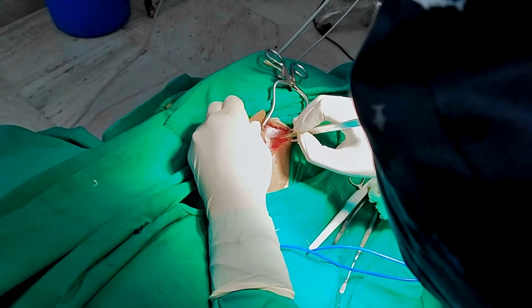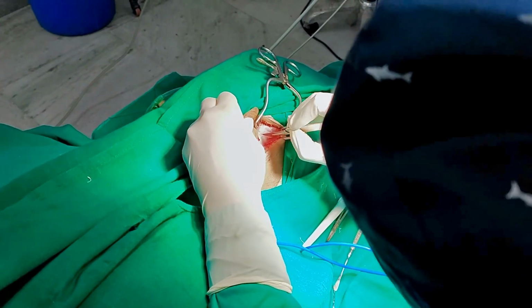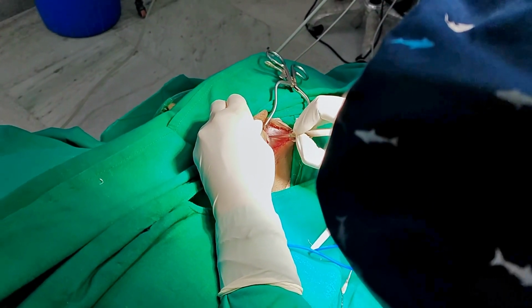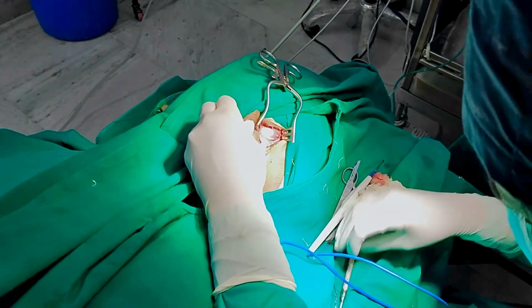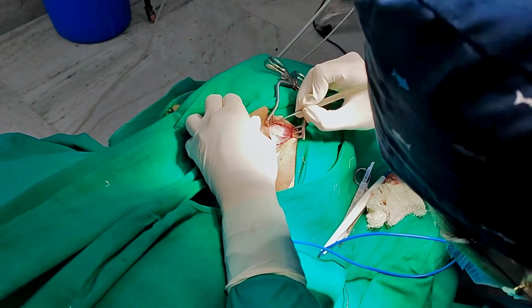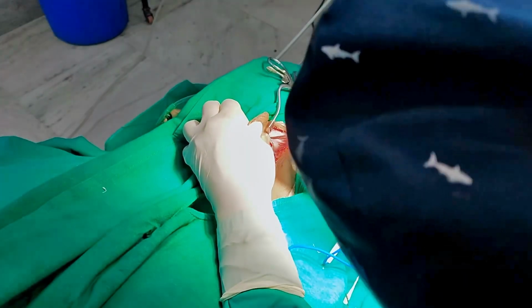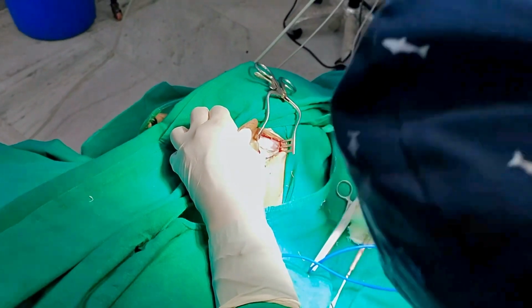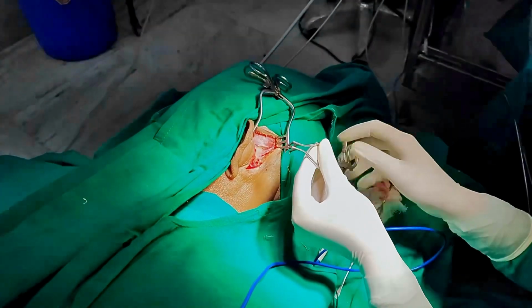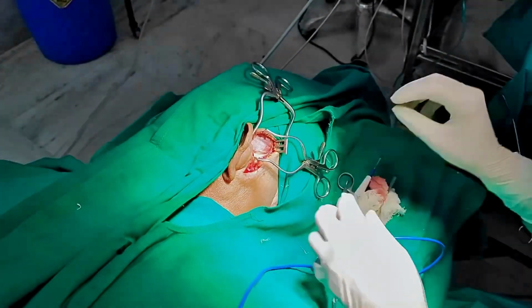And now we'll make an incision for collection of the temporalis fascia graft. So as we can see, the temporalis fascia is almost separated from the muscle.